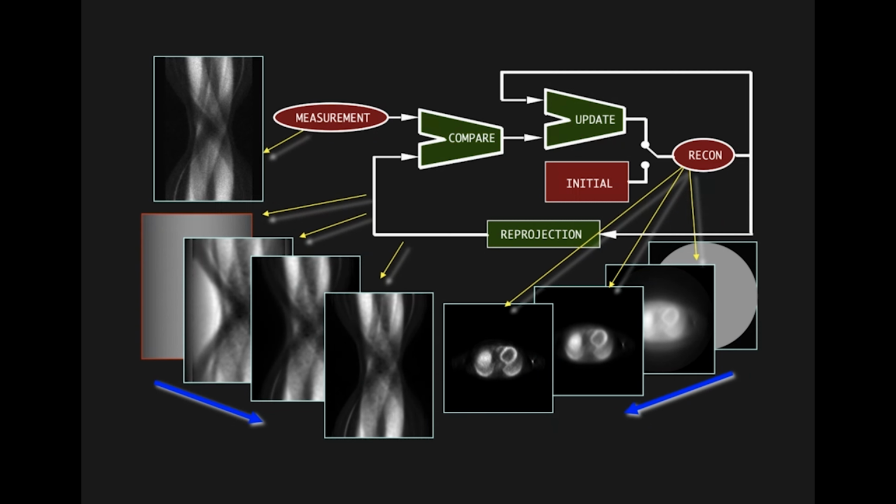And as I said before, if you work with relatively high dose CT, as you can do in elderly people, then the dose is not that relevant anymore. So then you can do it faster or with simpler reconstructions. If you go to noisy environments, you really need to do this, and then you just need the time or need to spend money in order to buy the supercomputer.